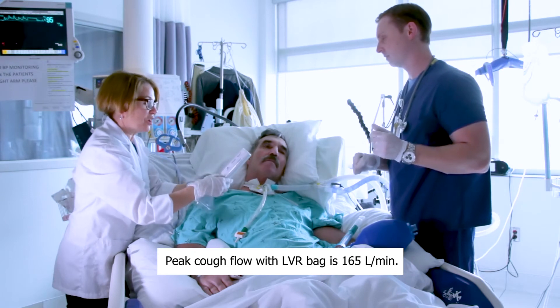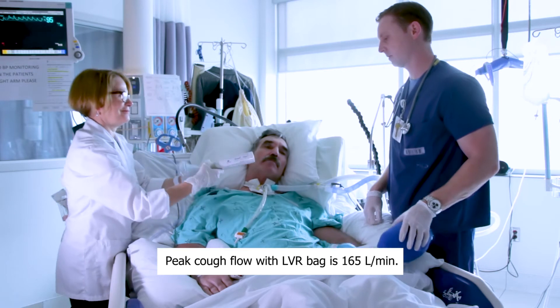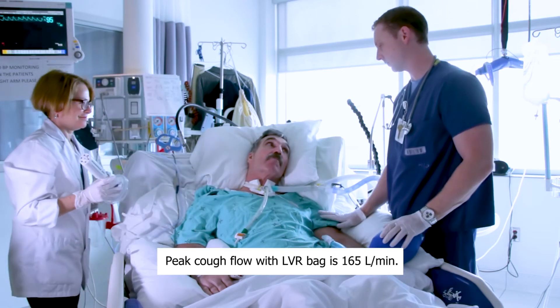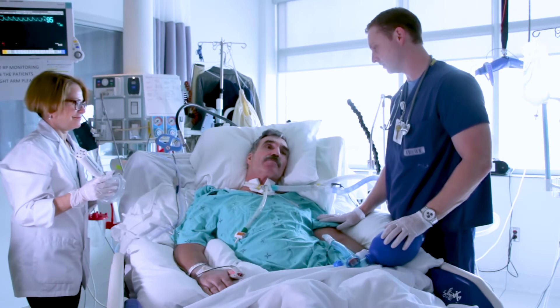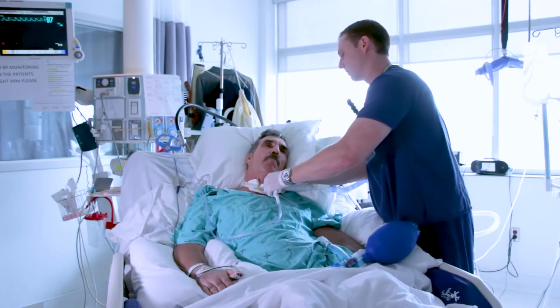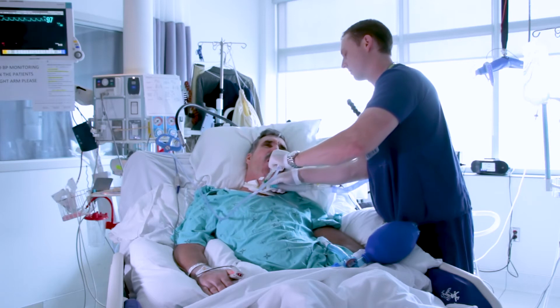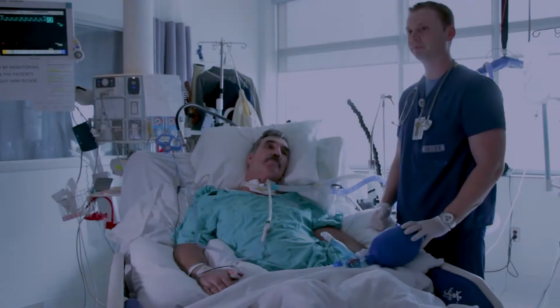The peak cough flow with lung volume recruitment is 165. How's that? You okay? Do you need a suction on your trach? I'm fine. Do you want me to suction you? You can, certainly — yes. Do you feel like you need one? I'm just going to go down and give you a quick little suction here.